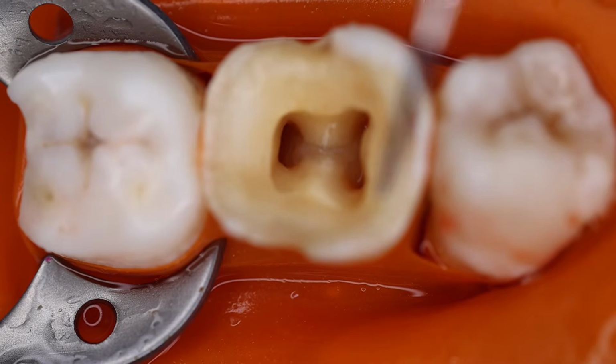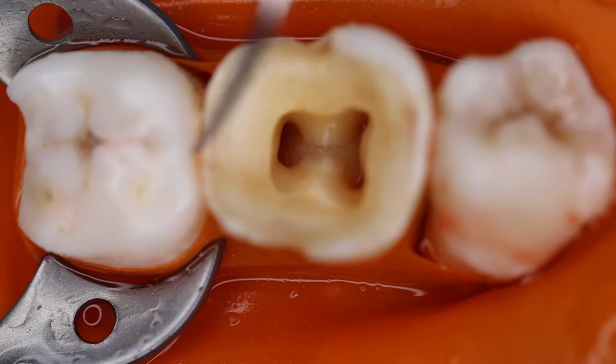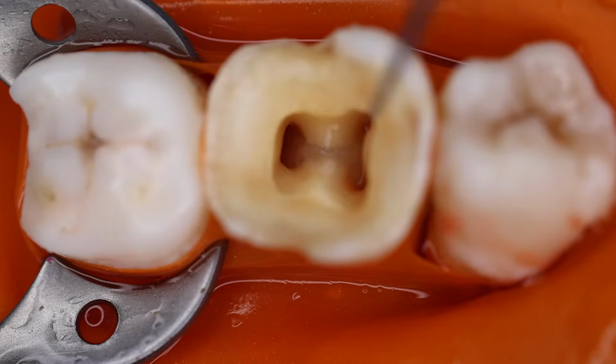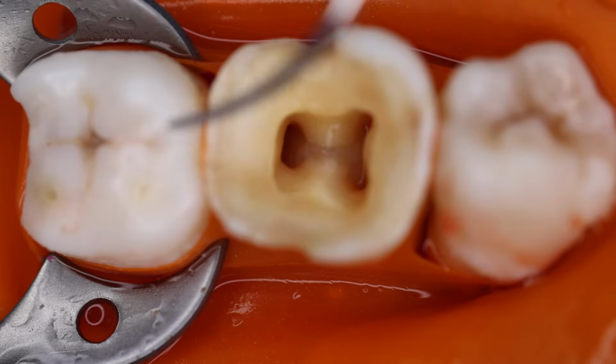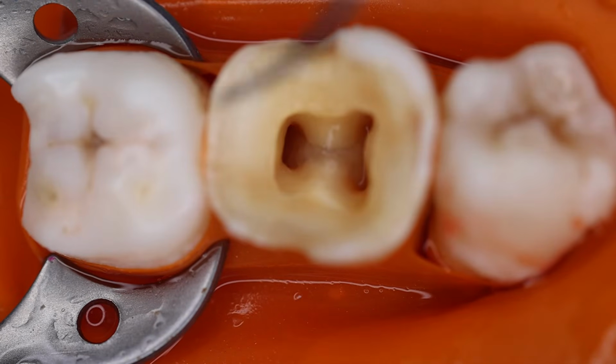So hope you were able to identify what we did in this access cavity preparation. We removed initially all the caries that we could suspect. The second thing is we maintained the healthy tooth structure to have a good reference point for the working length and the working preparation. The third was to identify all the canal orifices, as many as we can, and then we negotiated the canals. And now is the time to proceed with the working length determination with the help of electronic apex locator.